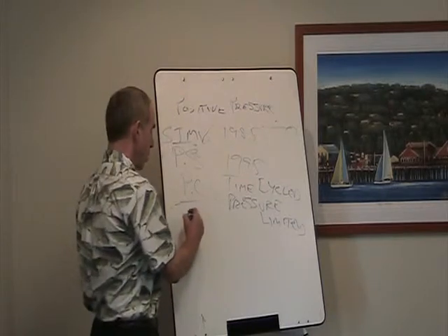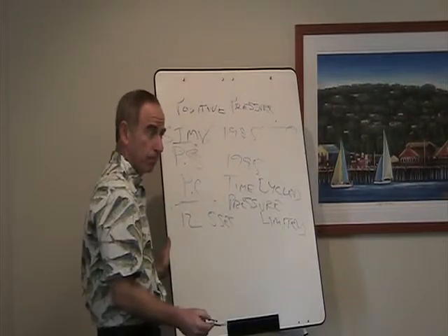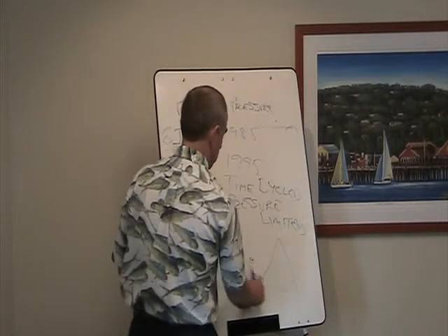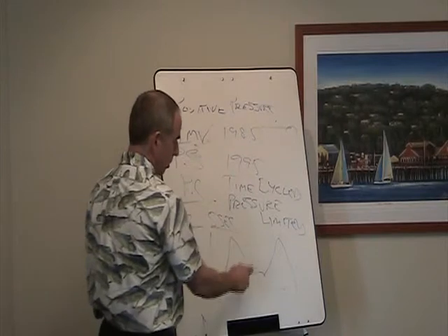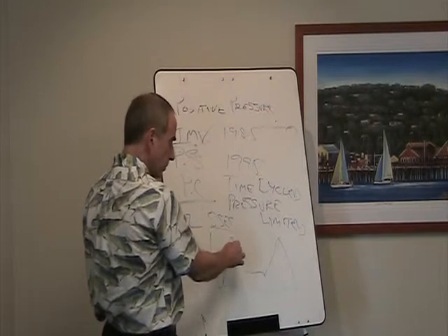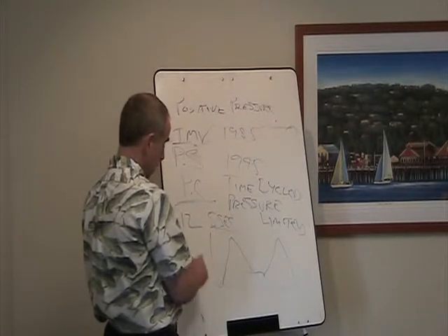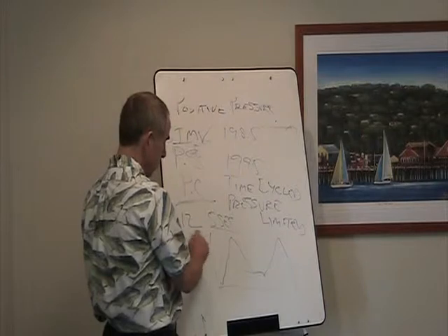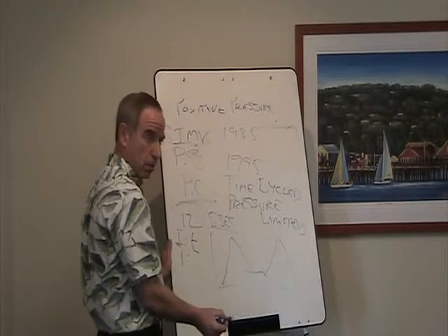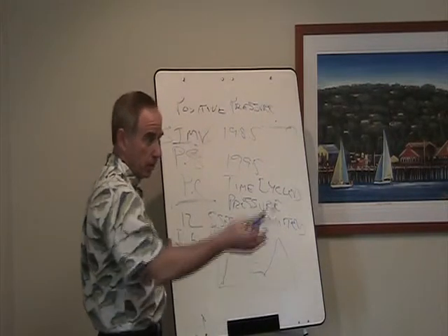So if you set a rate of 12, every 5 seconds that patient is going to have a breath, right? Okay, so in pressure control ventilation, you can set what you want the inspiratory time to be. So say I want an IE ratio. What's the normal IE ratio that we normally breathe with? 1 to what? 2. Okay. So expiration is about twice as long as inspiration normally with normal breathing.